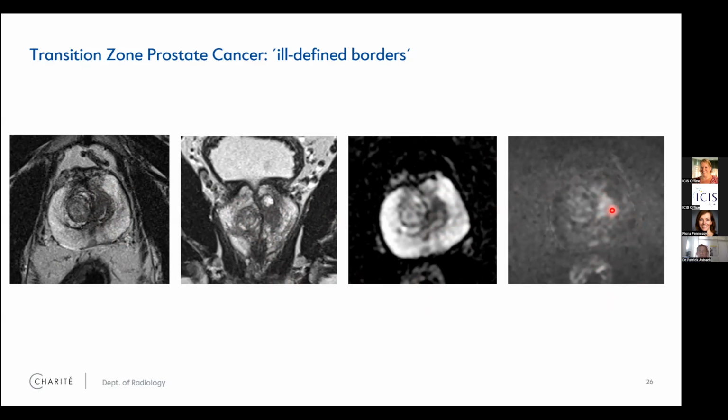So this corresponds to this black and white pattern of prostate cancer. And this accounts for a PI-RADS 4 lesion in the left transition zone. And this actually was biopsied, and biopsy showed a Gleason 4+4 = 8 prostate cancer in the left transition zone.